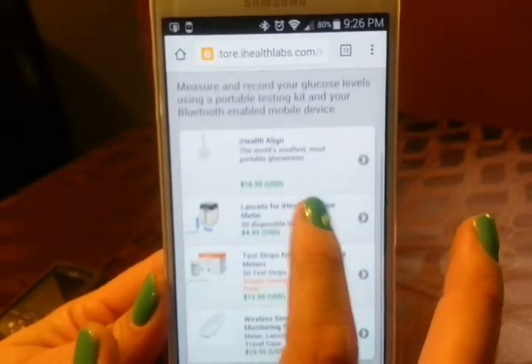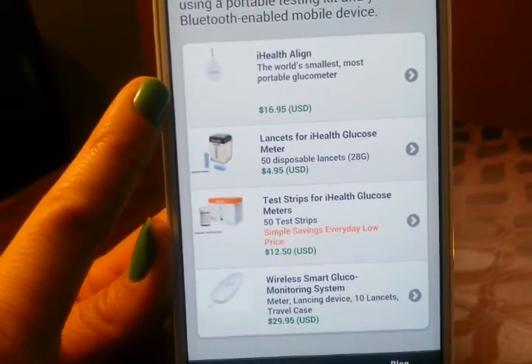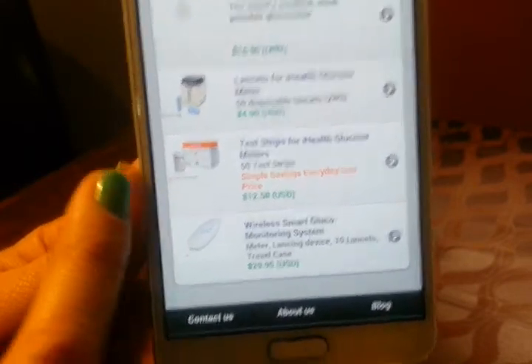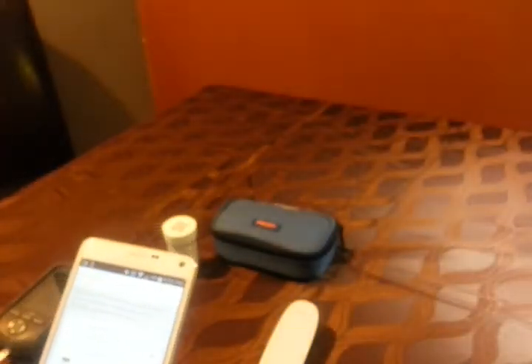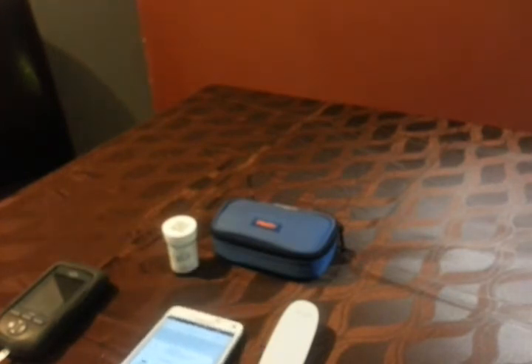When you go into the shop, you can see they have the kind of meter that you stick into your headphone port, and then they have the wireless that links via Bluetooth. Here are the strips at $12.50 for 50 of them, $4.50 for lancets, and then $5 for the little lancets — it uses generic-type lancets. Today is December 2nd and on Amazon they are $11.99, with free shipping on orders over $35.